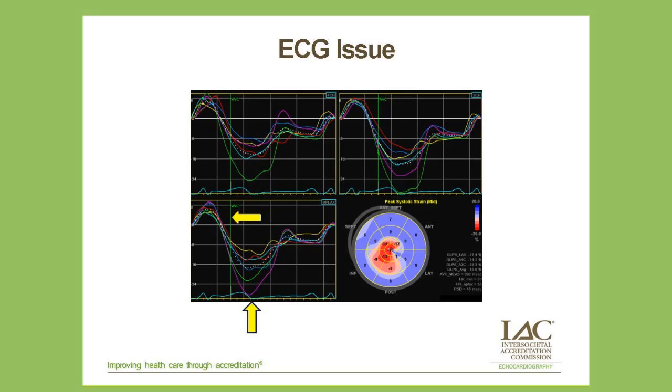But if you look at this overall, there are several issues here, one being the aortic valve closure prior to the T-wave. The other is, if you notice, here's our baseline. The strain curves are all negative curves, but if you look at our bullseye over here, you see positive values there displayed in blue, which really didn't make any sense to us.